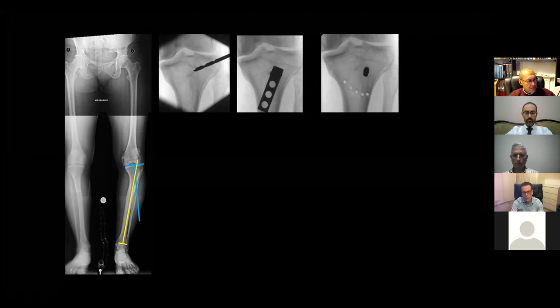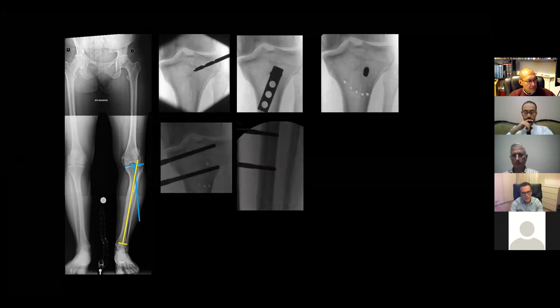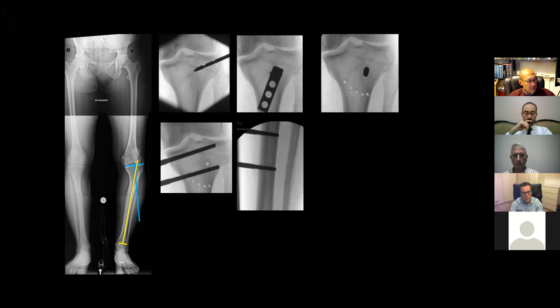You can perform the drilling of the osteotomy, as we heard yesterday in the osteotomy talk. And then we're placing our pins prior to completing the osteotomy. I point your attention to the fact that the pins are not parallel to the articular surface of the tibia at the knee joint, but factor in these 3 degrees as much as possible. Obviously, it's within the limit of our ability to judge these angles. It's not essential to be spot on 3 degrees, but if you take into account the small convergence, then you are more likely to get your correction spot on.